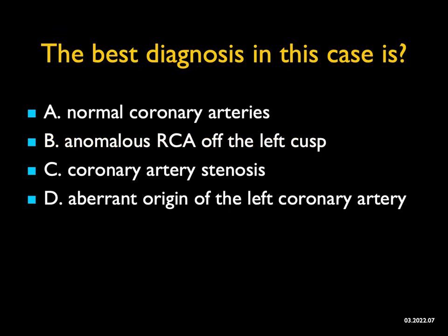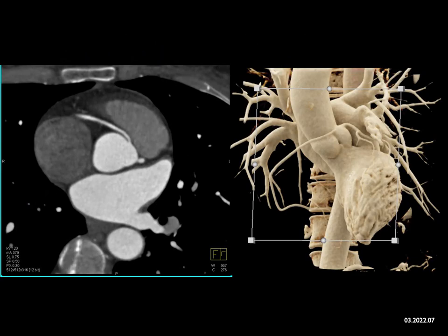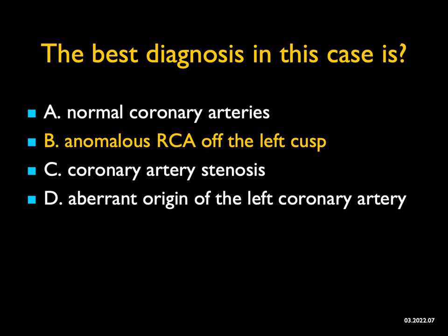The best diagnosis in this case — I'm giving you axial images and a 3D cinematic rendering. When you look at the axial images, what catches your eye is you see the left coronary, but then you see the right coronary is interarterial — it's between the ascending aorta and main pulmonary artery, arising from the left cusp. You can see this very nicely on the 3D cinematic, where you can really get a good feel of where the left and right coronaries are coming off the same cusp and their relationship to each other. The best diagnosis is an anomalous right coronary artery arising off the left cusp — the so-called malignant configuration.